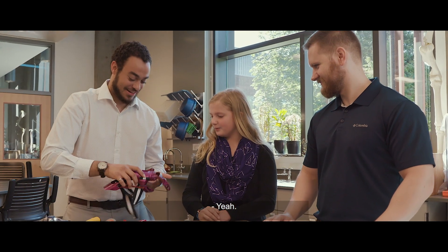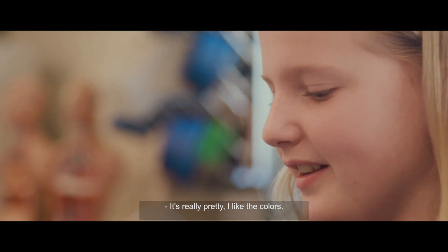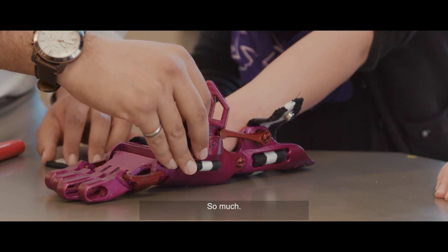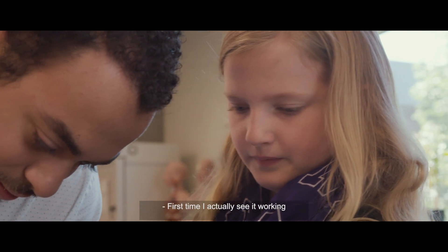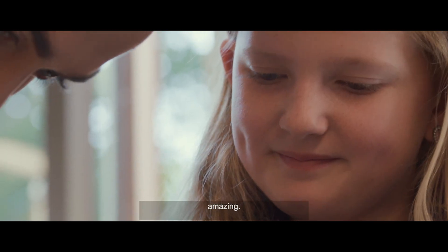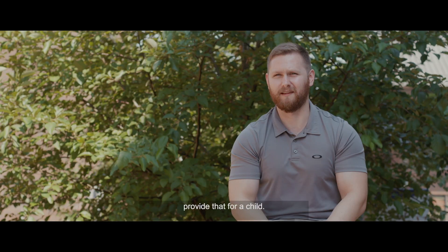Ready? Oh, it's pretty. There it is. It's really pretty. I like the colors. I'm going to size that on your arm. Thank you so much. It looks better than I ever imagined it would. First time I actually see it working is just going to be amazing. It's kind of unspeakable to be able to provide that for a child.